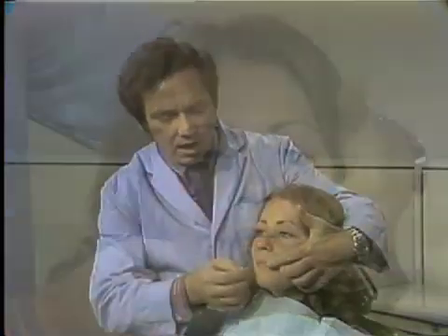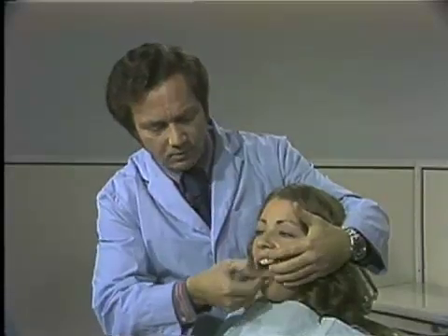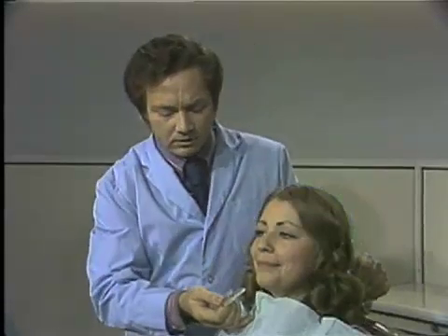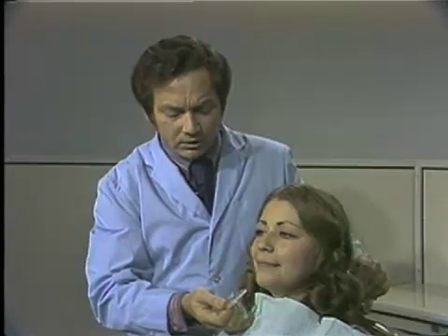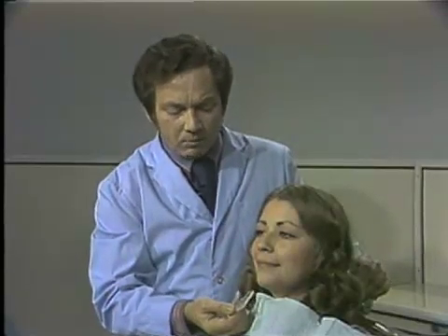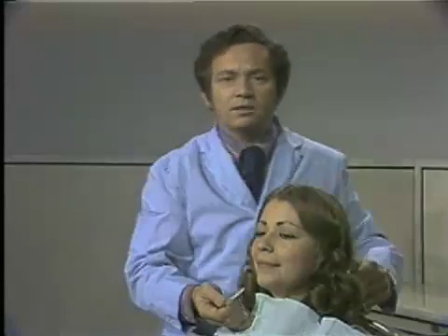Together with enhanced muscle relaxation. Now how do we construct this maxillary acrylic occlusal splint, which is the most often used, but yet abused, appliance? Let us have a look at the basic construction procedures.